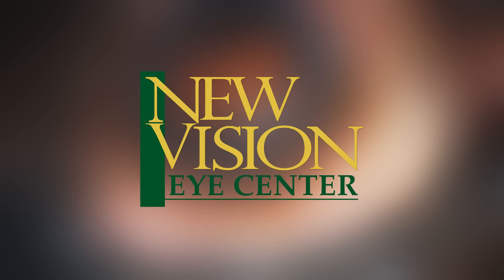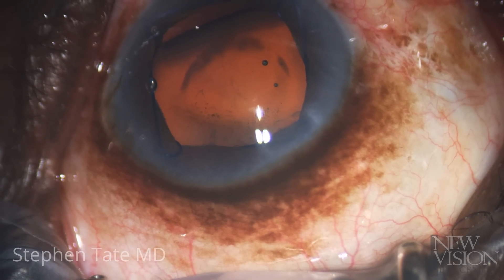This case shows a 70-year-old male patient with an endothelial cell count of 1,400 cells per square millimeter. He underwent uncomplicated cataract surgery with a Malyugan ring in his right eye two weeks prior.